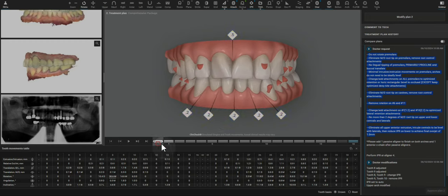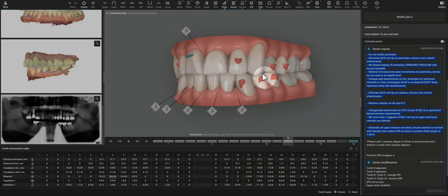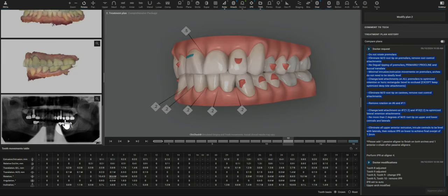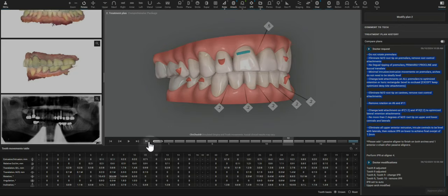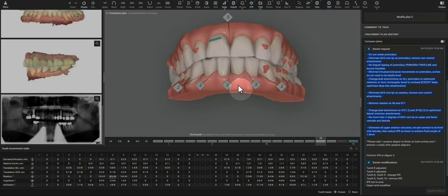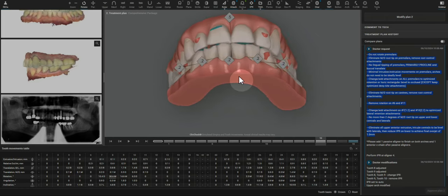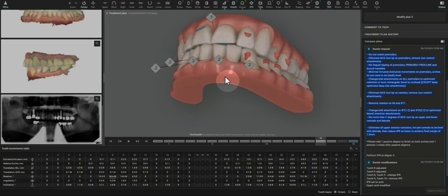When I look through, we can't expand very much through the left side premolars because there is an implant present. I think there's more expansion that could be done on the right side premolars, so I can do that with the 3D controls.